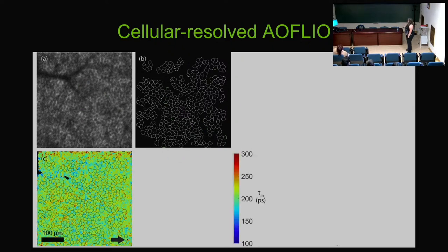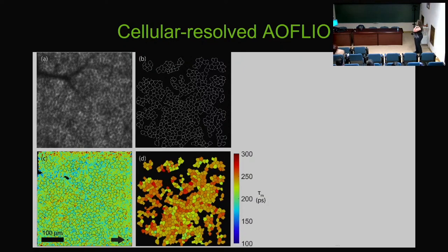And if you overlay that onto the fluorescence lifetime image, if you look really carefully, in every individual cell there's sort of a variety of things happening. And we can start considering those. But we also said, well, what if we just looked at the average of a cell and said, okay, we're going to sum all of the pixels within that cell, generate one histogram, and create one lifetime for each individual cell. And if she does that, she actually sees a much tighter clustering of the fluorescence lifetimes.